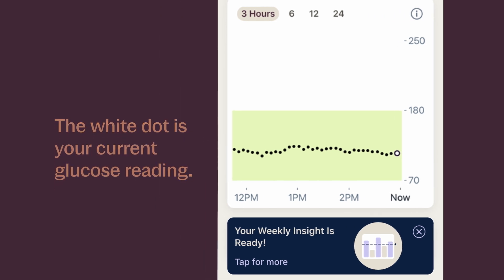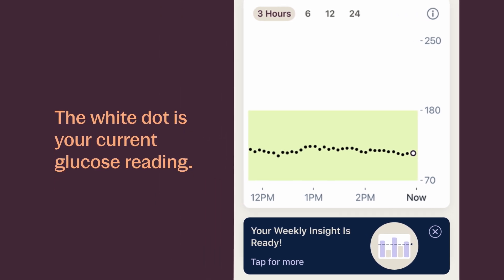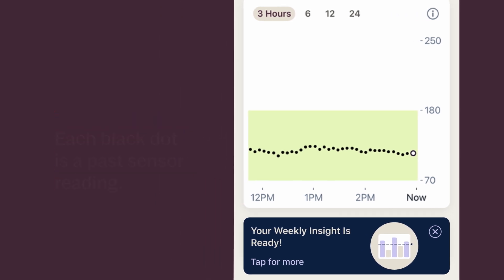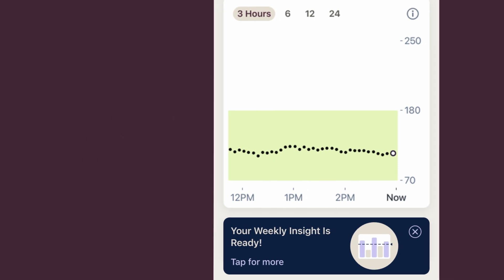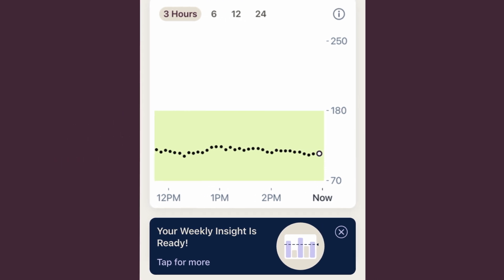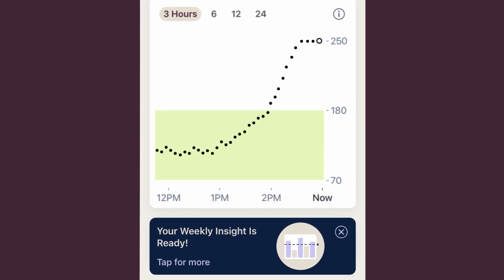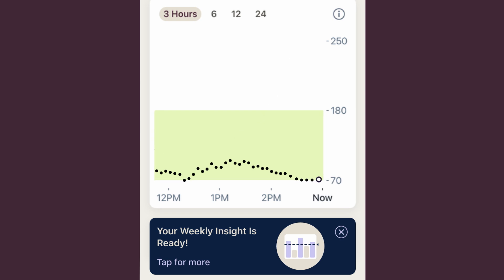In your graph, the white dot is your current sensor reading. Each black dot is a past sensor reading. The dots will be lined at the top or bottom of the graph if you're above 250 or below 70.